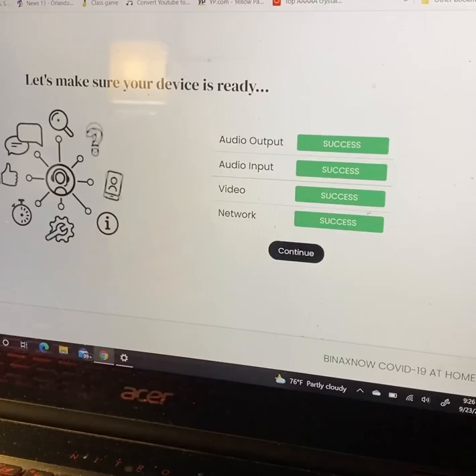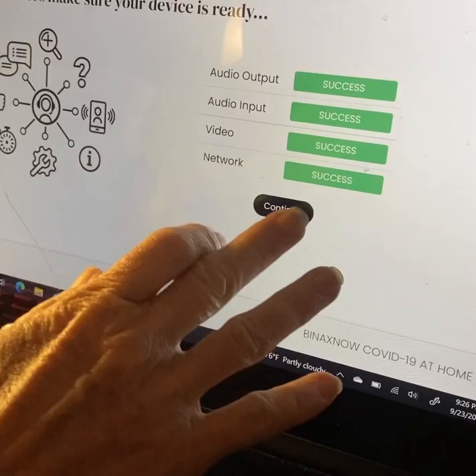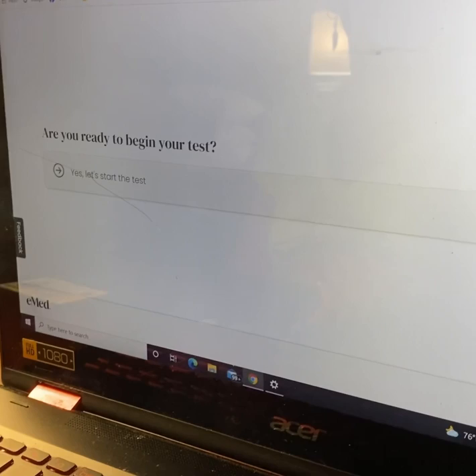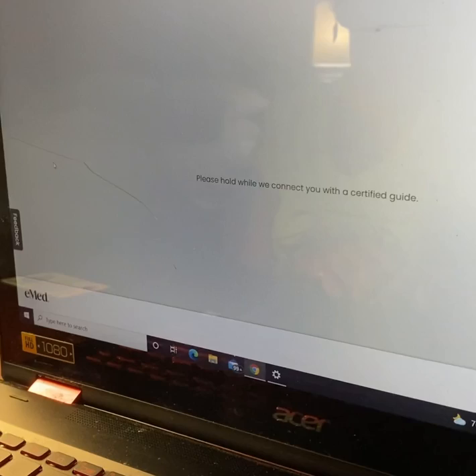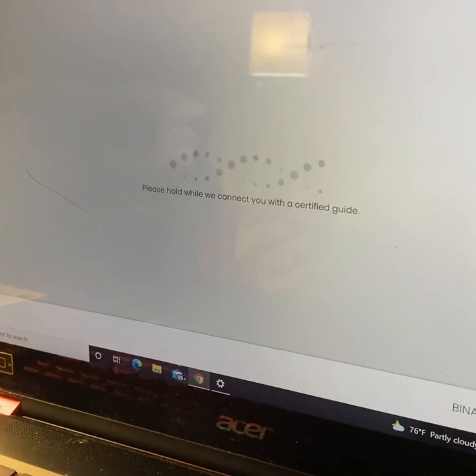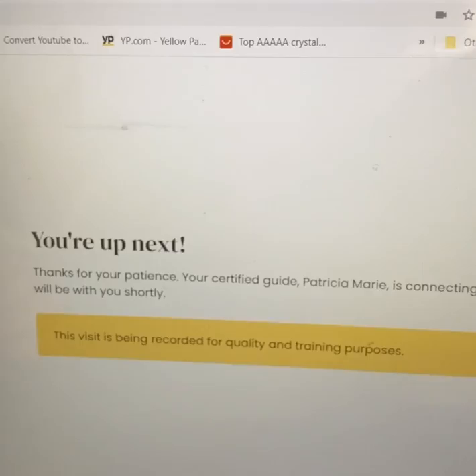Are you ready? Yes, you're ready to begin your test. Okay, so now I guess it'll put us in the queue like yesterday and it'll tell us how many people are in front of us. And we're next, okay.